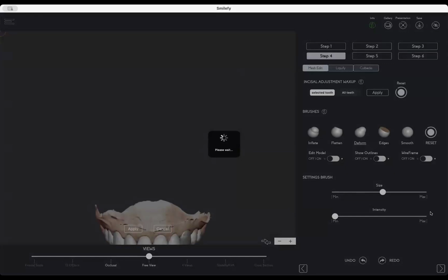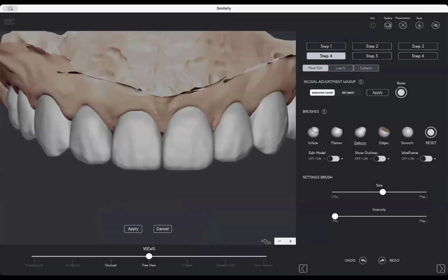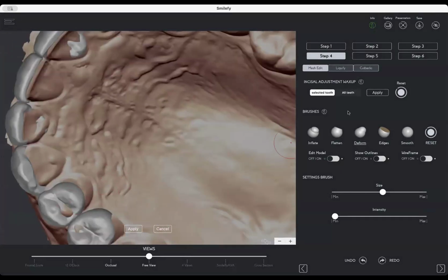In your case, it's an additive case. How would it be if the case was a reductive case and the teeth need to be prepared back? In other words, there is a way, of course. Okay. Let me answer this question and go into detail.